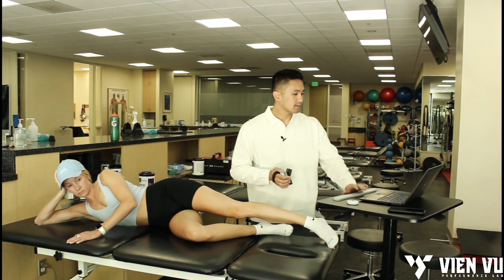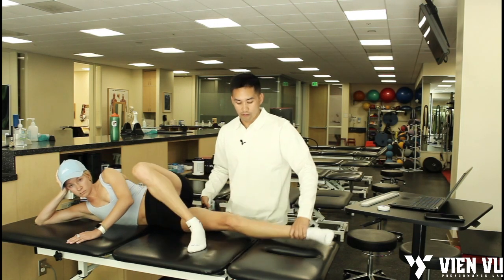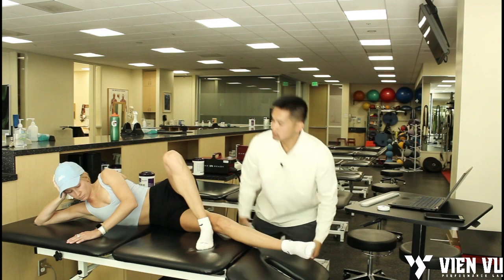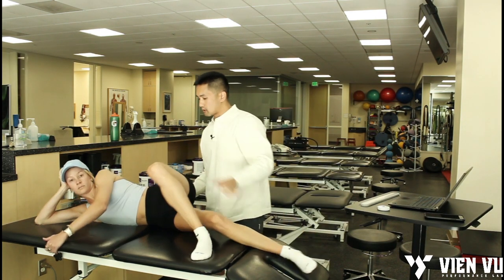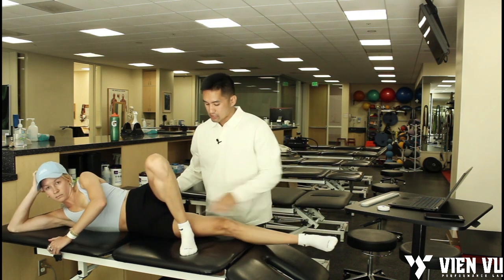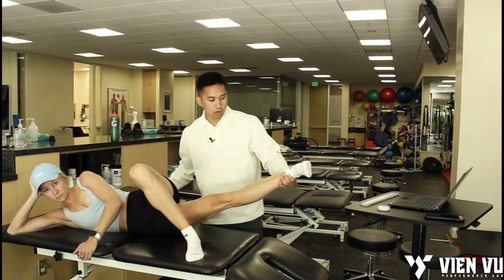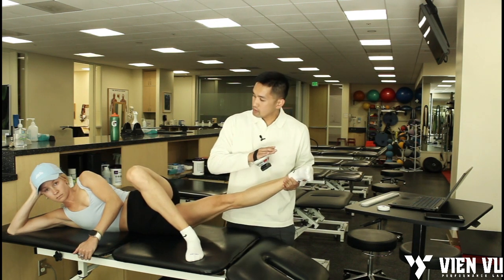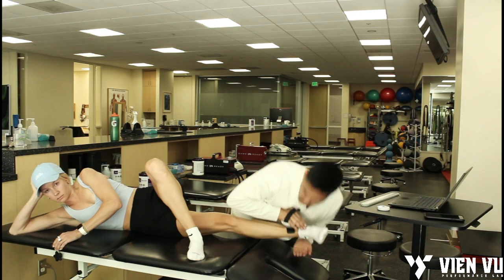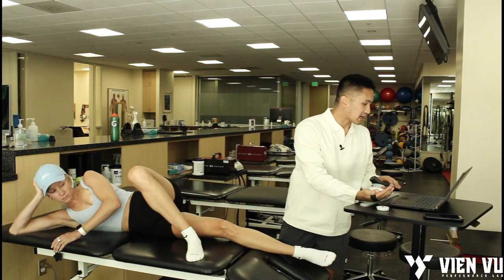Now I'm going to test involved adduction. Scoot your hips forward, get this leg straight, make sure the thigh's not touching. We're going to lift it up here — don't let me beat you. Ready and go — push, push, push, and rest. I'll enter that for involved adduction — that's 33.7.